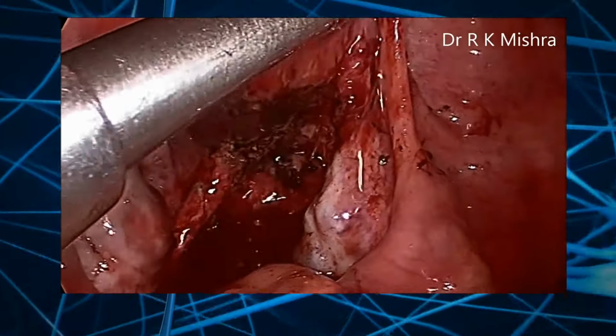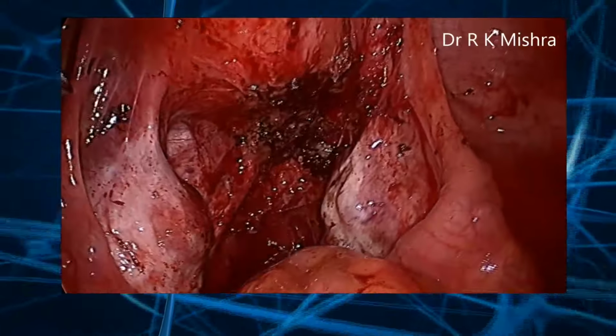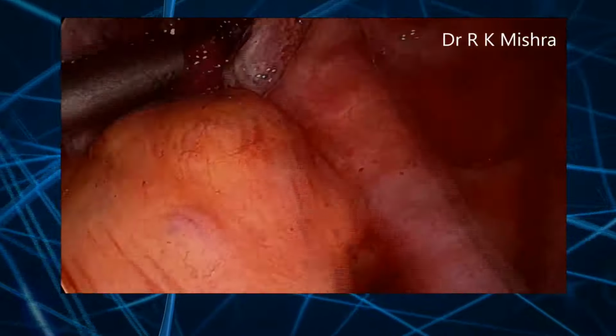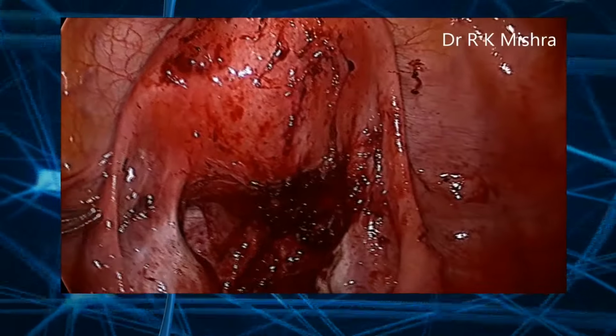Again irrigate, suck. And now you can use an Interceed.